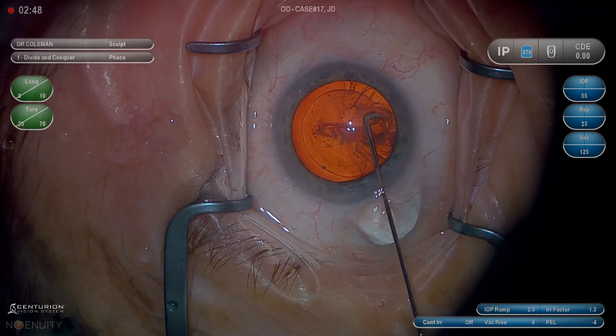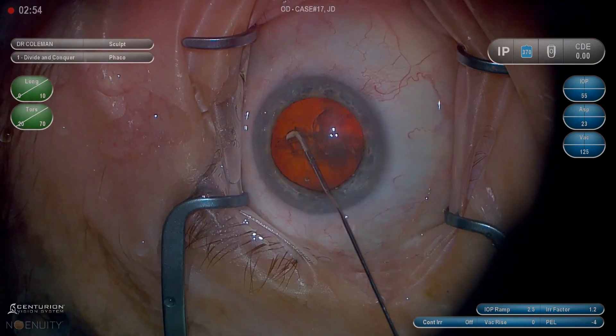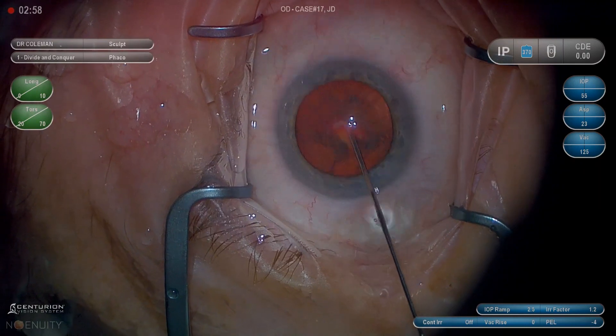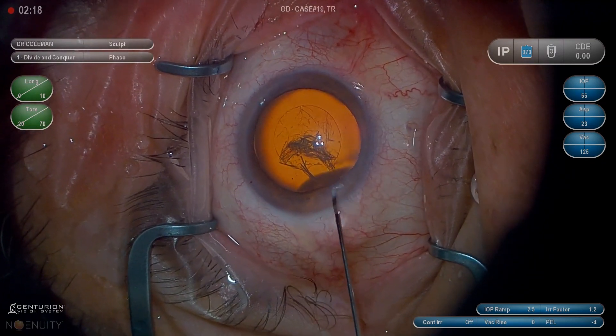One thing I always like to point out with hydrodissection is that it's really about pressure and not volume. Volume creates blooping of the lens and causes iris prolapse. Pressure in waves gives you a good, complete hydrodissection.